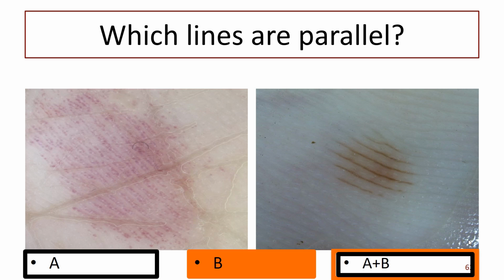Right, so just hazard a guess as to why you think they're in the furrows. Would anyone like to contribute to this? Tell us why do we think these are in the furrows? Any clues? Furrows versus ridges. So we're talking about mountains and valleys. So if you look at your hands, you can see you've got mountains and valleys on your hands, fingerprints and so on.